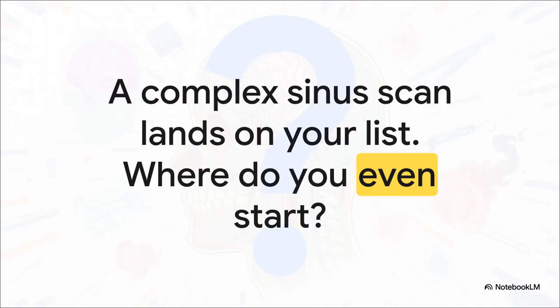You know the feeling, right? We've all been there. It's the middle of a long call, and this monster case pops up. The sinuses are totally whited out, the anatomy looks like a maze, and the list of what it could be is a mile long. This whole explainer is designed to give you a clear, step-by-step approach so you never feel that way again.